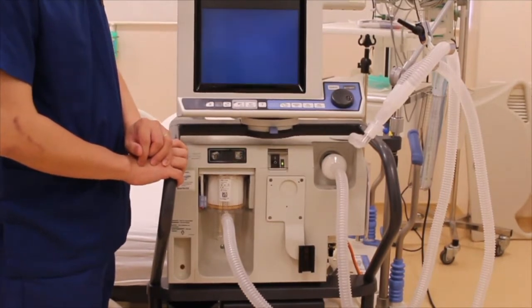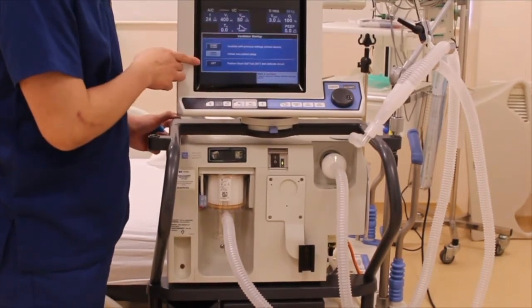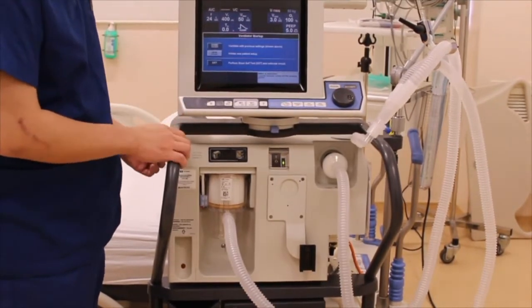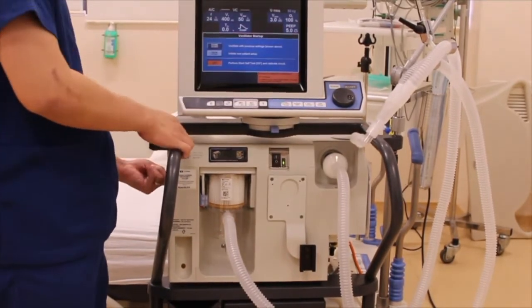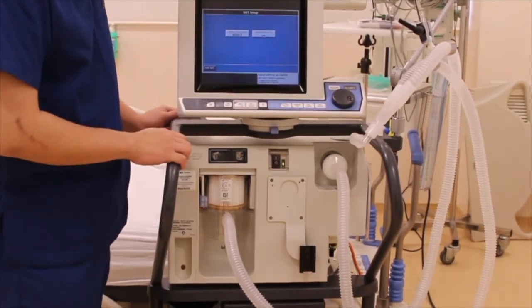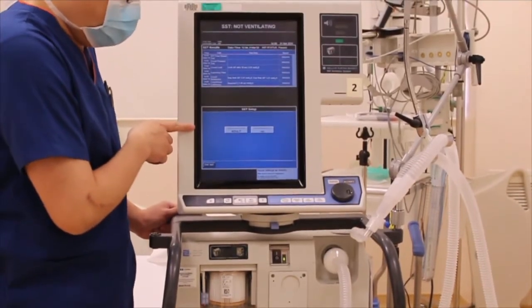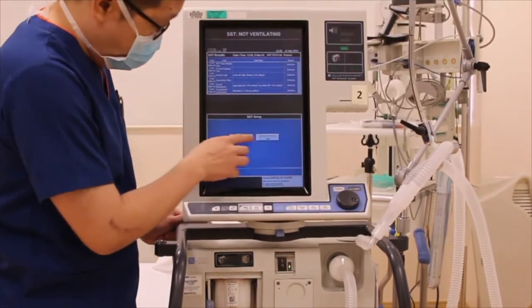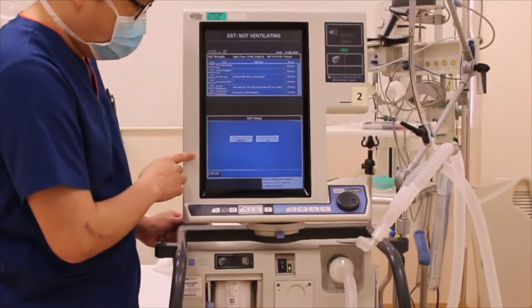After the welcome screen has been shown, you will have an option to perform the SST. When that button is pressed, I will at the same time activate the test button at the side. It has now come to the SST setup screen. We need to select the type of circuit — for this particular demonstration, we are using an adult disposable circuit. For humidification type, we will be using a heat-moisture exchanger (HME) for this demonstration.